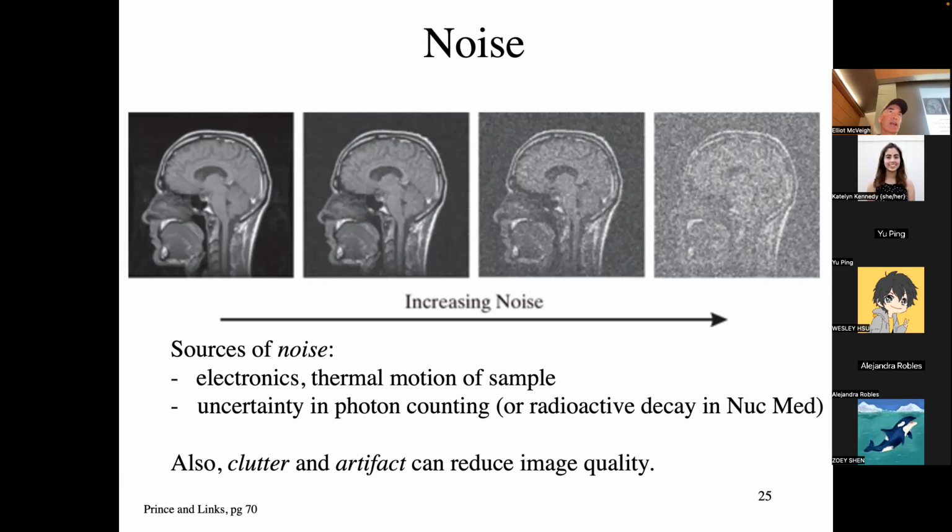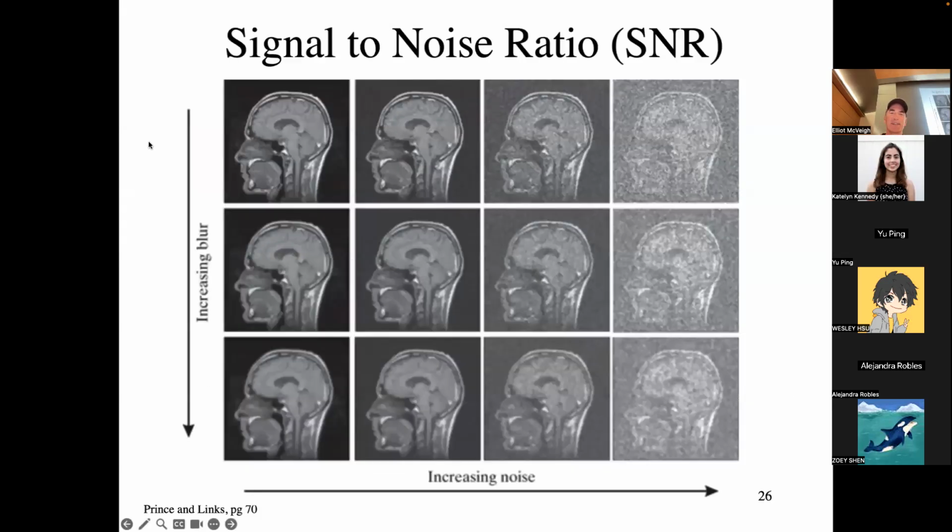When you're looking at an MR picture and all the vessels are doing some strange pattern, you ask, how do we encode flow using this signal? It's something you didn't predict, but if you knew how to control it, you could image it. So a lot of artifacts can be turned into good imaging techniques. But in MR, there are review articles of the 94 most prominent artifacts in MRI.